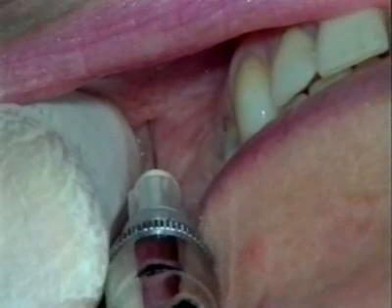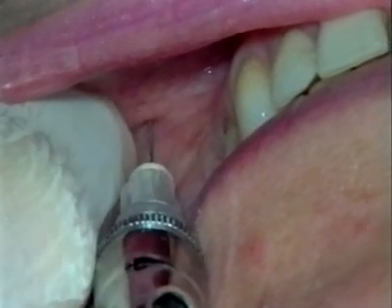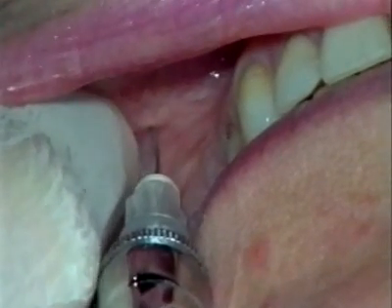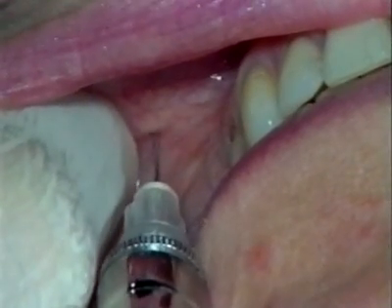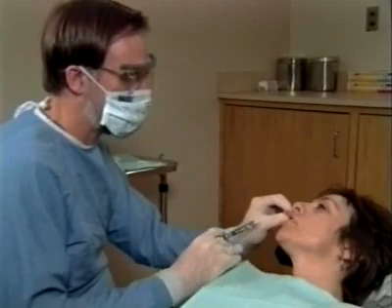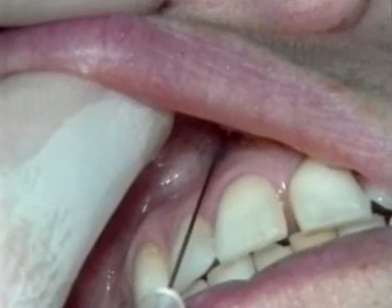After negative aspiration, injection is made with the palpating finger remaining in place to help guide local anesthetic solution into the infraorbital canal. A total of 1 milliliter, or about 1/2 of a dental cartridge, is injected slowly. As with all other injections, the needle is then slowly withdrawn. Because of crossover fibers from the contralateral side, anesthesia of the central incisor may be incomplete unless a supraperiosteal injection is made over that tooth.